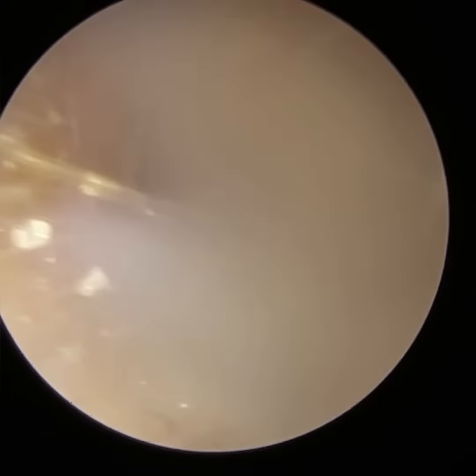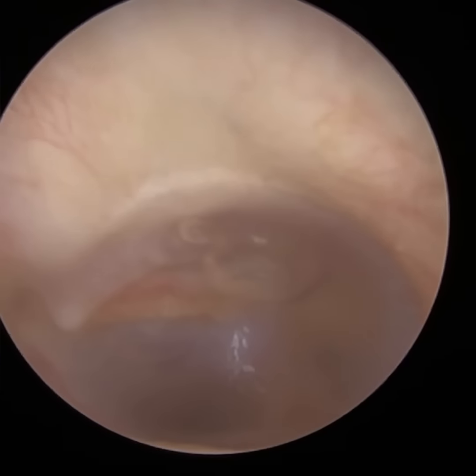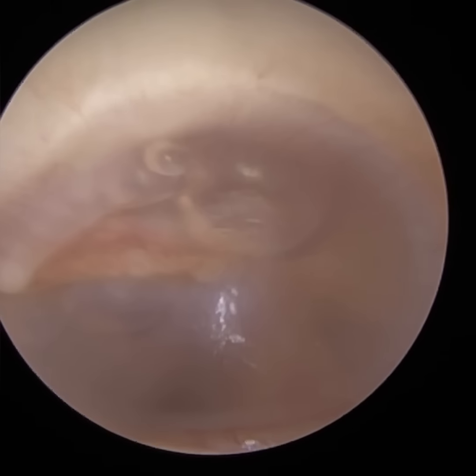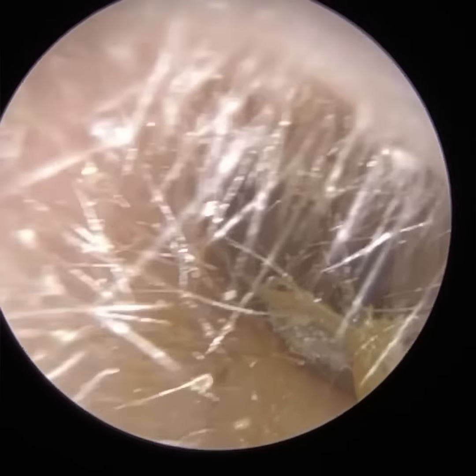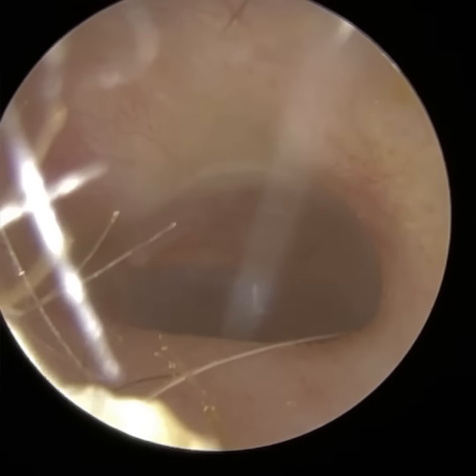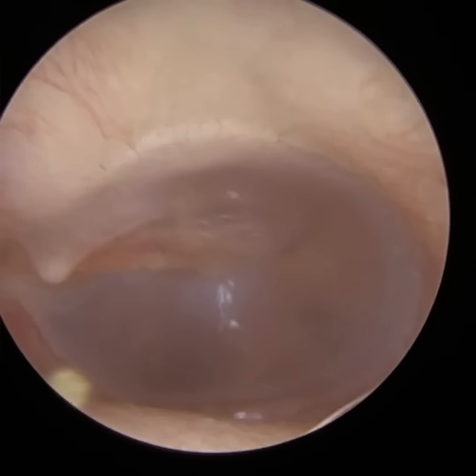Generally it served me quite well, but in very hard lumps of wax I just wasn't able to penetrate and glide through. So this patient — at first appearance you may think they've got a normal eardrum, but you can see maybe a couple of bubbles there. This patient's got a condition called secretory or serous otitis media, also known as middle ear fluid — a buildup of non-infected fluid.